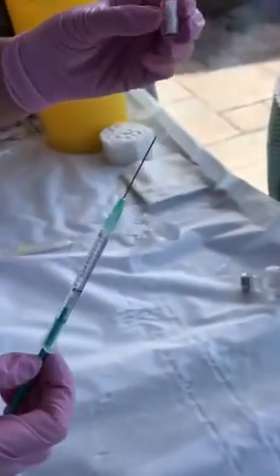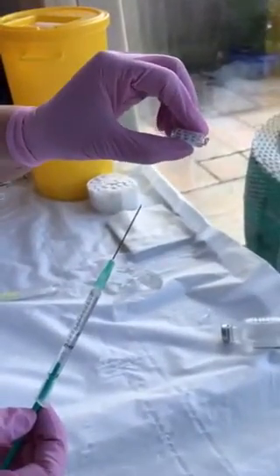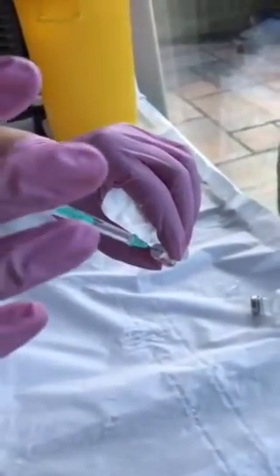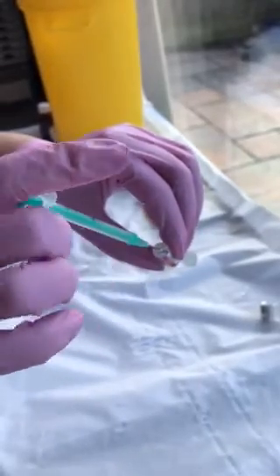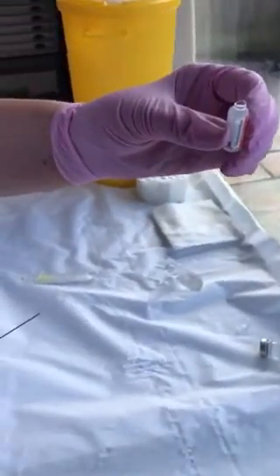I've then got my little vial of hyaluronidase, which I've already taken the top off of, and the expiry date is September 2019/20. I'm then going to place the 1 mil of saline into the hyaluronidase solution. Give it a little shake like that. Okay, so you've now got 1 mil into that solution.